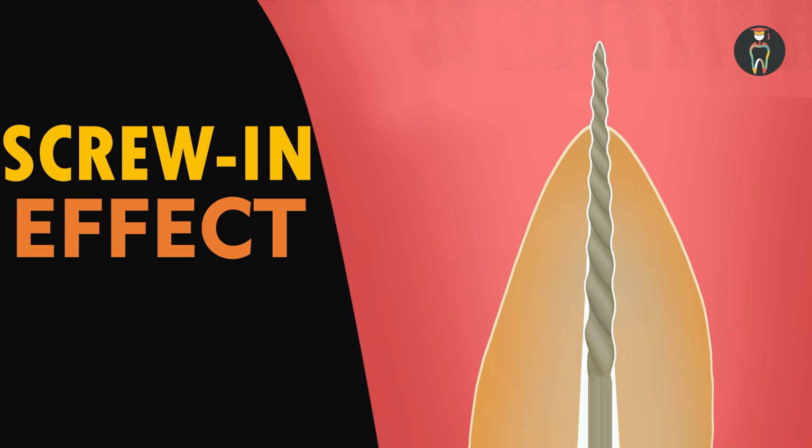Is it a continuous taper or a progressive taper? What is the tip design, an active tip or a passive tip? What metallurgy is used, austenitic or martensitic material? What is the helical angle? Do the blades have land or no land? Is there an alternating cutting tip, or are all the flutes at the same level? All these factors have to be taken into consideration.